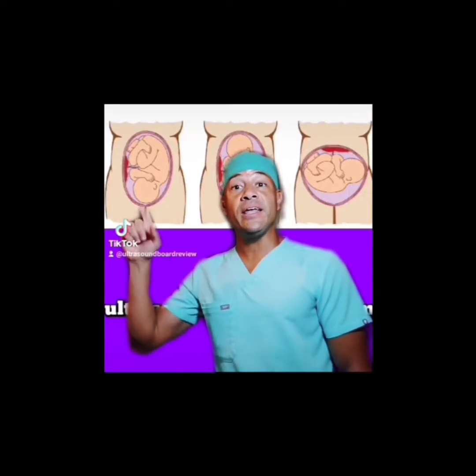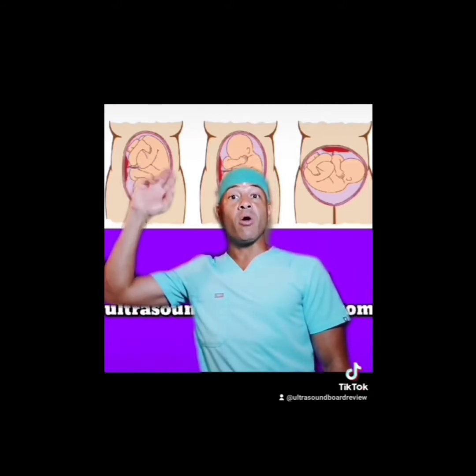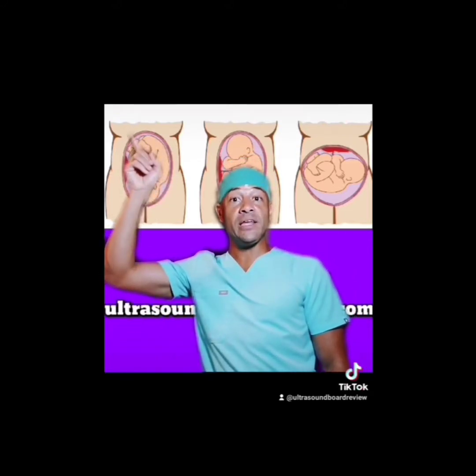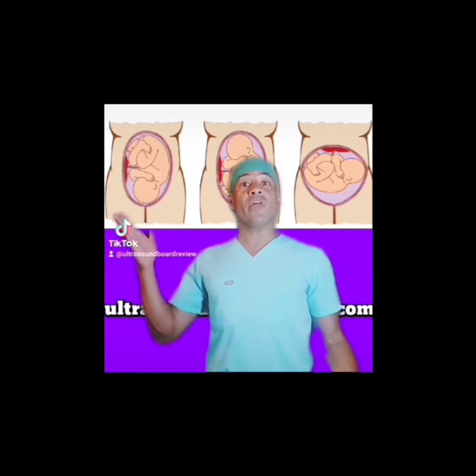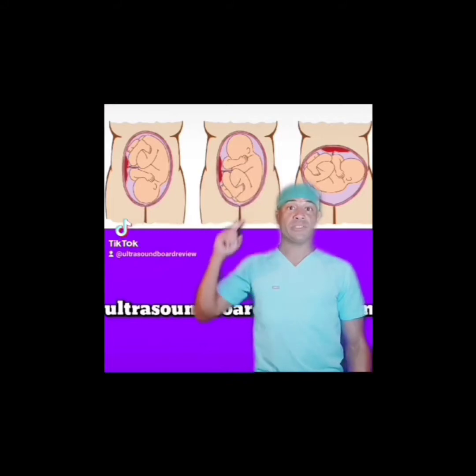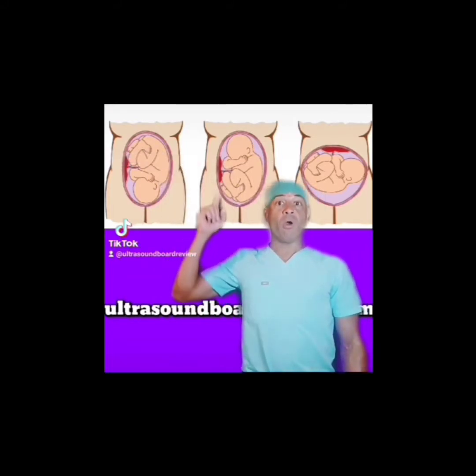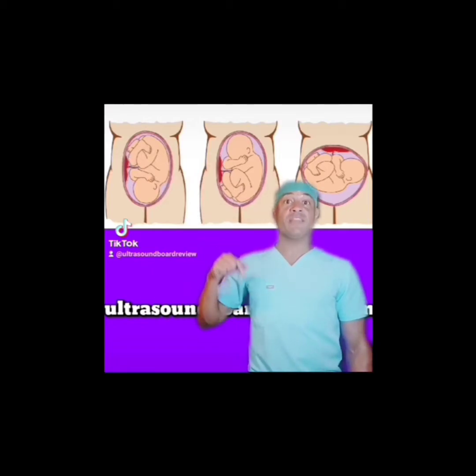This is where the fetal head is oriented down towards the mother's feet, or caudally, and the fetal feet are oriented towards the mother's head, or cranially or superiorly. It's important to know that cephalic and vertex mean the same thing. The second type is called the breech presentation, and this will orient the baby's head towards the mother's head, while the fetal feet will be directed towards the mother's feet.